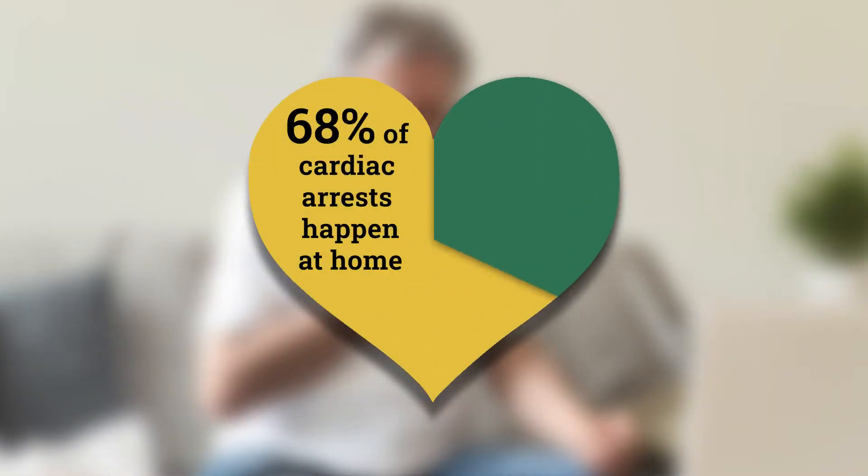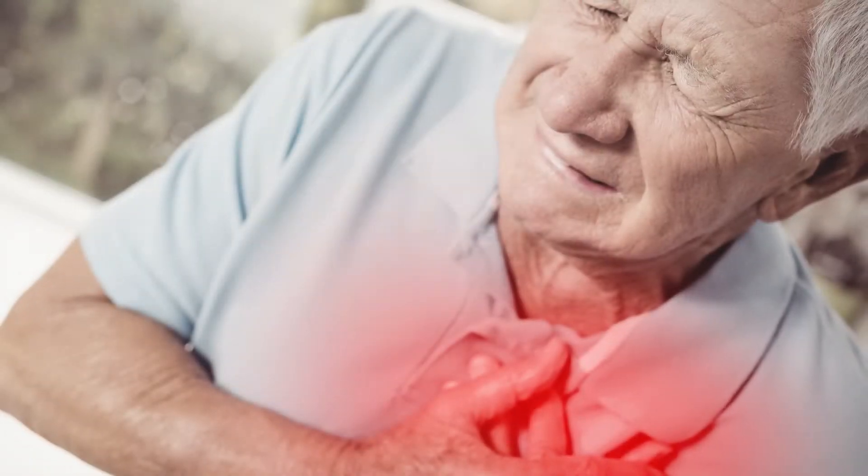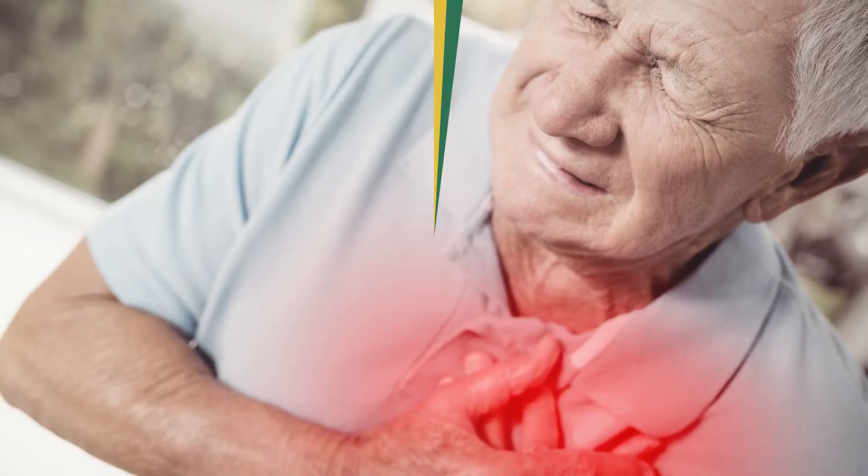Over 68% of all cardiac arrests in the United States occur in the home. How can you be prepared when a crisis happens? Watch this video to find out.